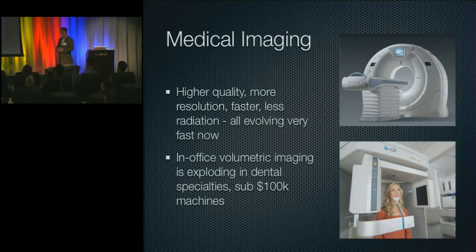There's even, surface scanning wise, a whole lot going on for teeth. If we look at the aligner product, where you're moving teeth around and you need aligners to fit and move them, the ability to take a scan of the mouth digitally is a huge push. The technology is already there, moving that way, and it's still in its infancy, but it's a big business. Many billions of dollars have been spent on research to get away from having to put putty in your mouth, and I'm sure many of you had to do that getting orthodontics or whatever. Historically, you take impressions, which are again not so pleasant for the patient.